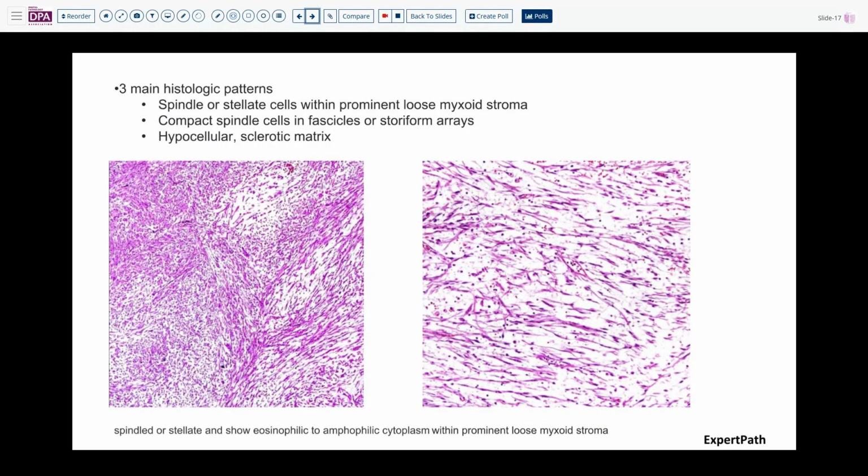We should see a lot, not just a little bit. We should see a lot of mixed inflammatory cells, including neutrophil, eosinophil, even plasma cell. So remember, this one is really important because some of the cell types usually in other entities we rarely see, especially remember the neutrophil and the plasma cell.